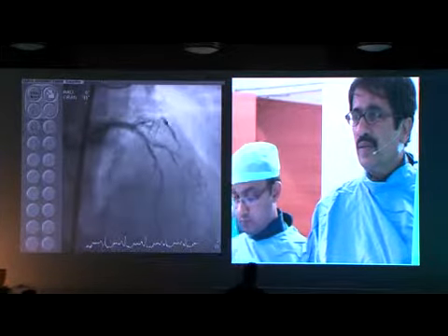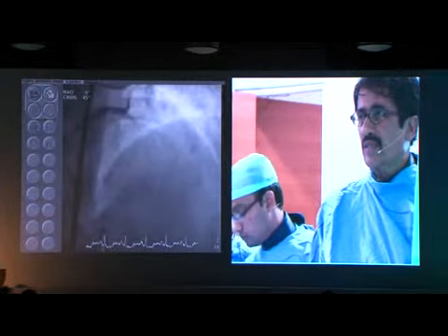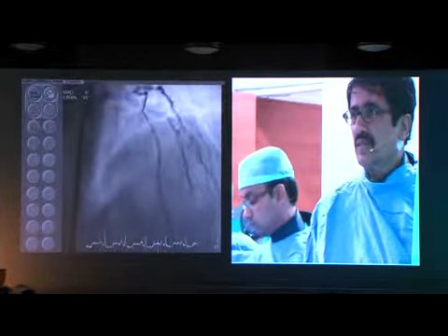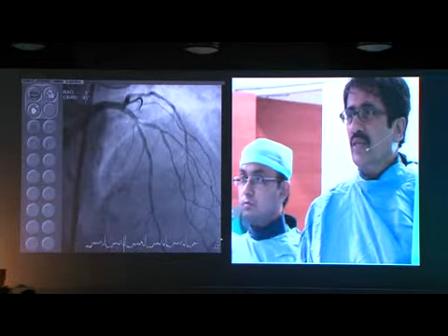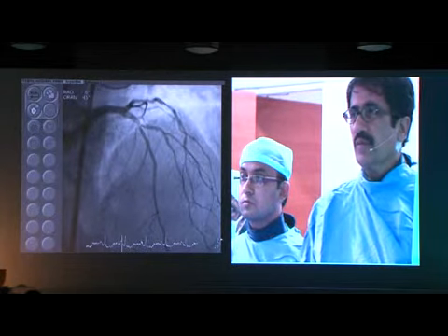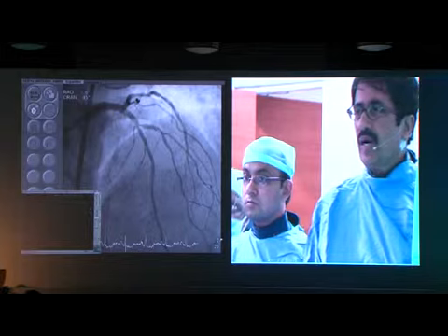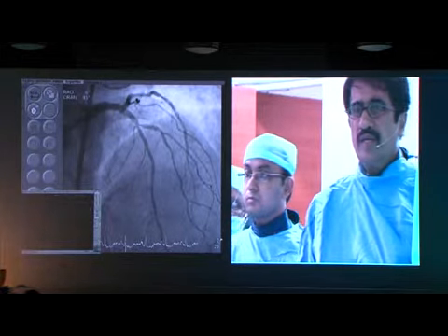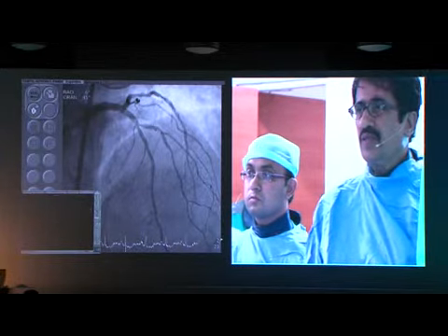The diagonal you can see is a very long vessel with multiple branches. Can you freeze this? Now we have various options for handling this critical diagonal lesion. How many of you think the LAD lesion is also tight, needs to be addressed, and could be contributing to angina?